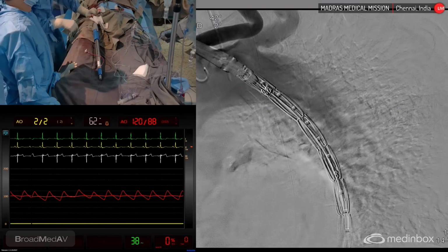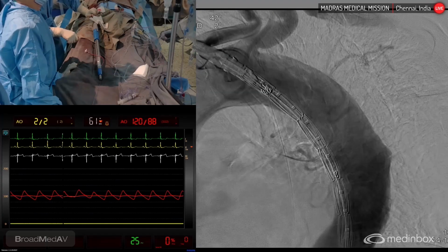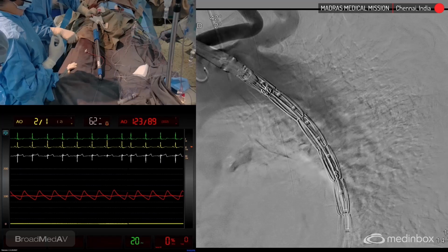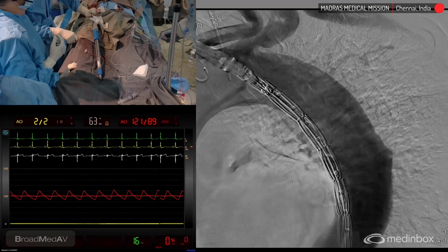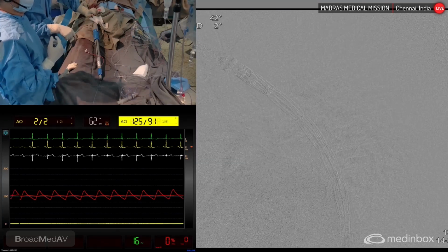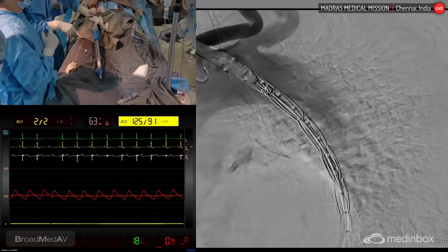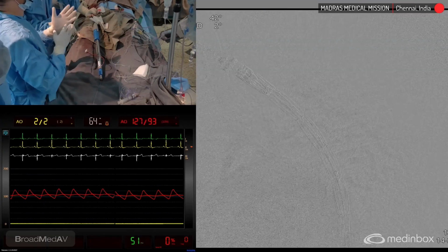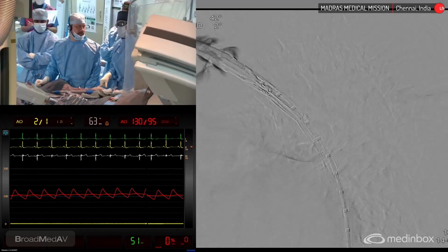Okay. Breath back. I think he'll be fine once we open up. It'll slowly open it up down. See, when we deploy a stent, it will try to come down due to windsock effect. So when it comes down, I think we'll be at the exact site.